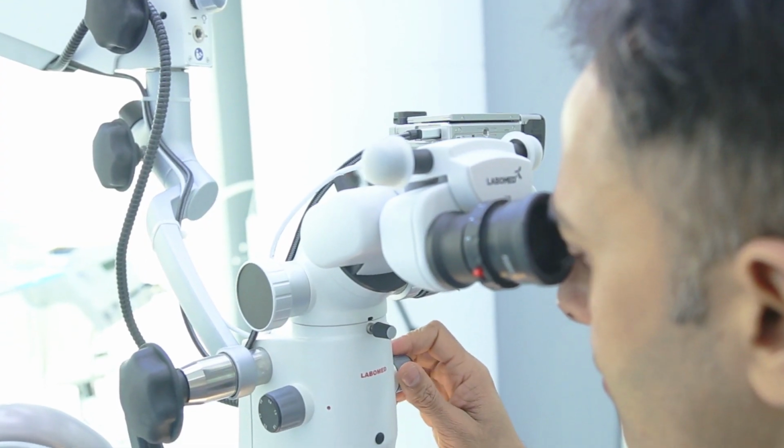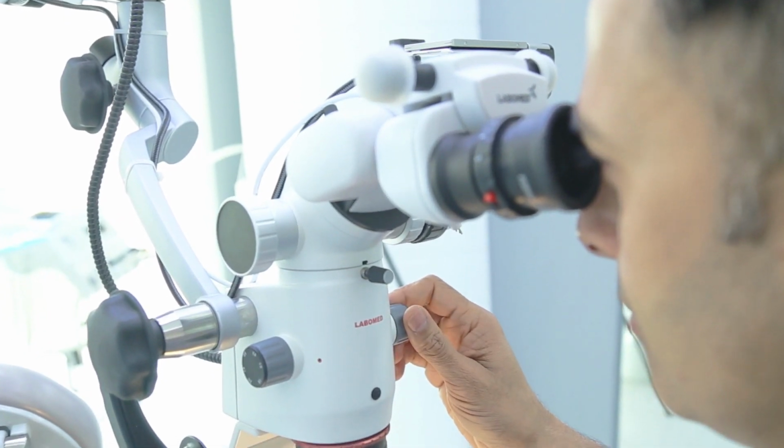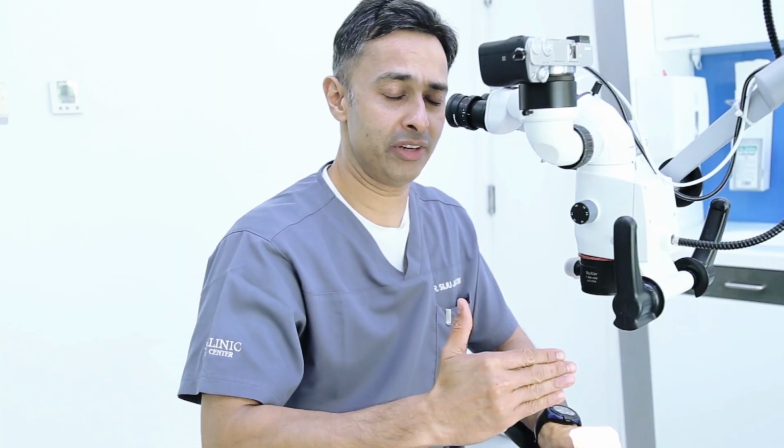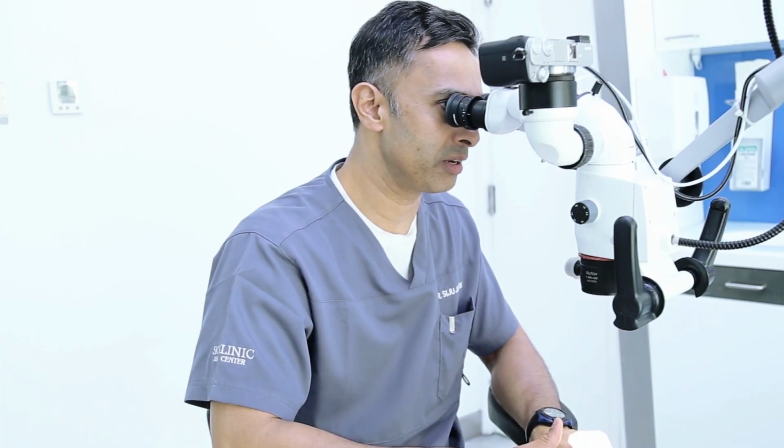microscope is. Now, this is a microscope and I've kept it at the lowest possible mag, which is around 3x. And if I look at my fingers through this lowest magnification, which is 3x, I can see all 5 of my fingers. But if I start increasing the magnification to around 5x, you see that I can't see all 5 of my fingers. It comes down to around 4 fingers. And if I keep increasing the magnification all the way up to 20x, what happens is you can actually visualize a single hair follicle, and it's possible to do surgery on a single hair follicle.